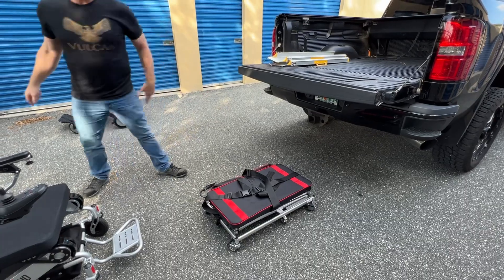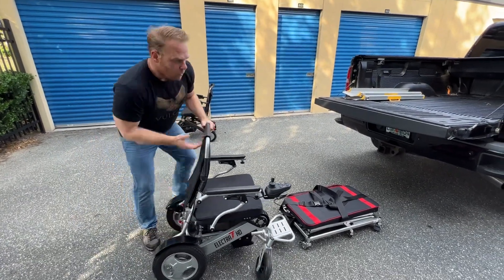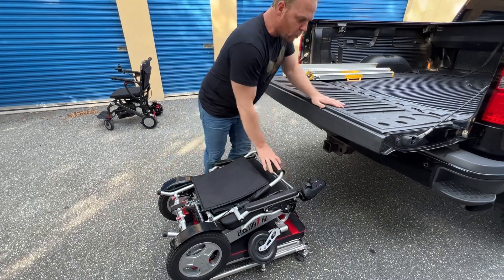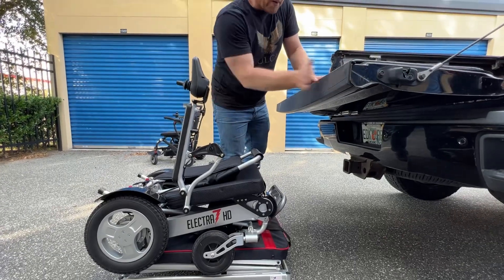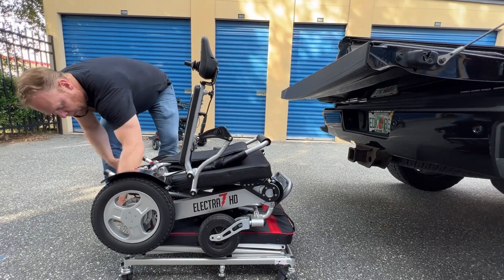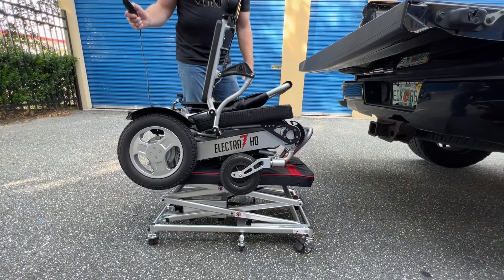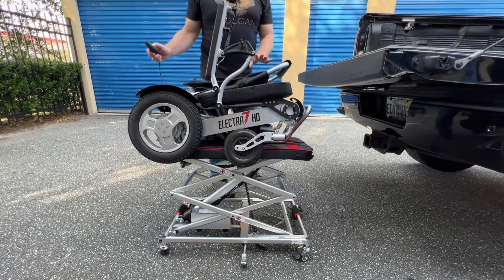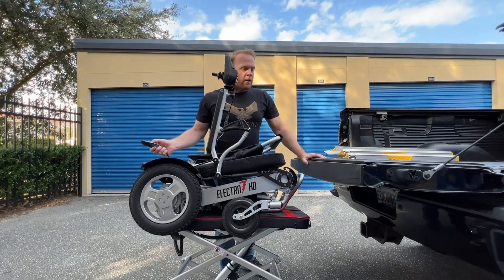You have the ability to strap the chair in. I'm going to be very cautious and careful, so I'm not going to use the strap option right now, but I will fold this chair up and bring it over, gently get the chair on the actual lift. I'm going to make certain the joystick does not run into the truck, or I'll just lift the arm up so it doesn't hit the tailgate. Once I do that, I'm going to make certain that I have the controller in my hand. I would always advise strapping the chair in — without it, an accident could cause injury, damage the chair, or damage the vehicle.